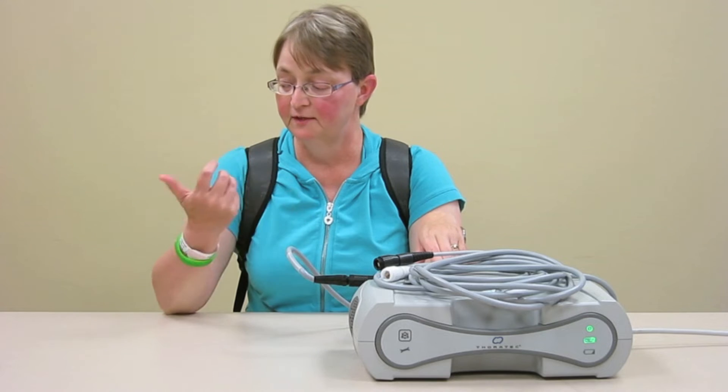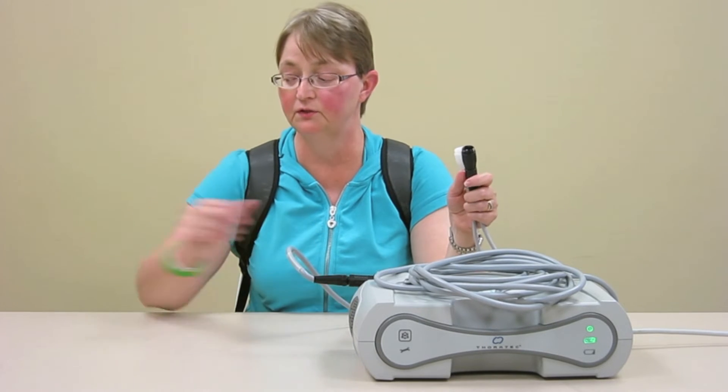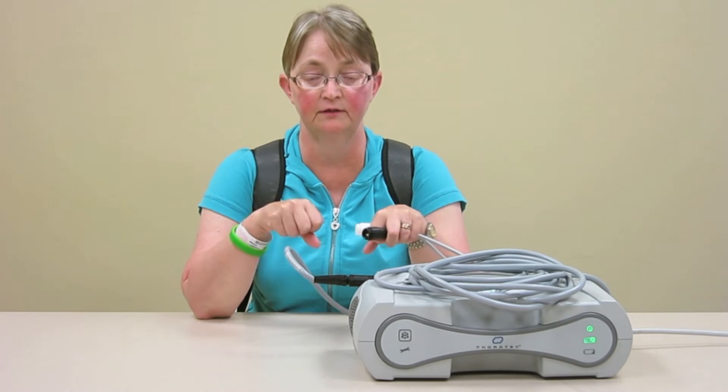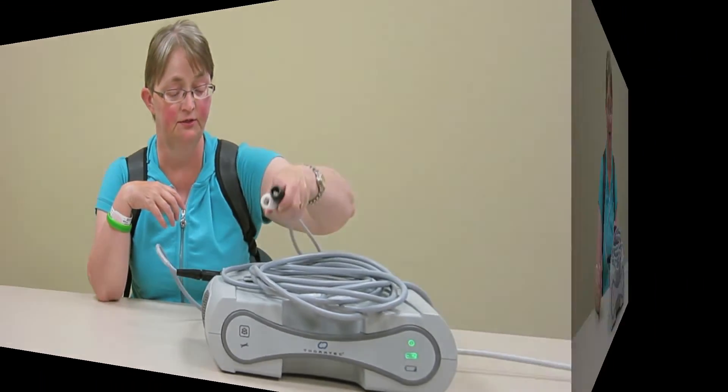It has the same type of wires as your controller has. You'll notice that there is a white and a black one, so you need to make sure that when you're disconnecting from your controller, you're looking the white cord into the white and the black into the black. Nice and easy to do.